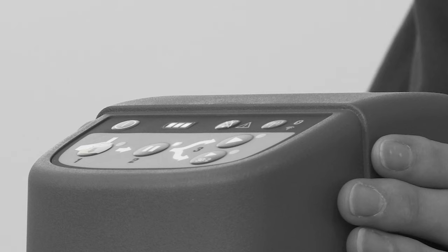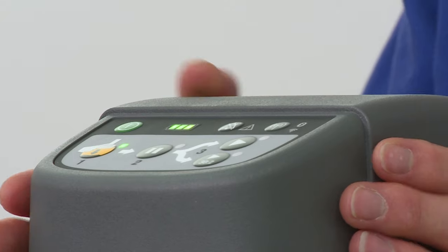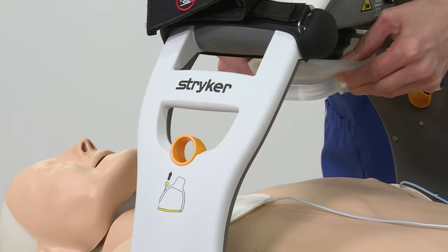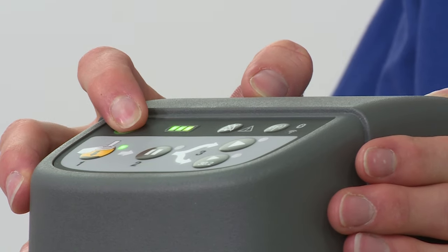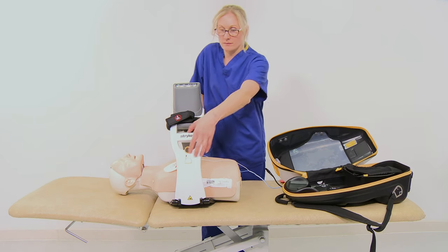To remove the machine, press the button and lift the suction cup away from the patient. Press and hold the on/off button to turn off. Lift the release clips and unlock the device from the backboard.